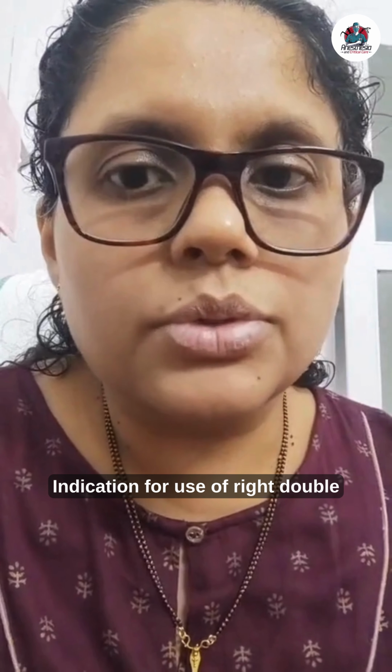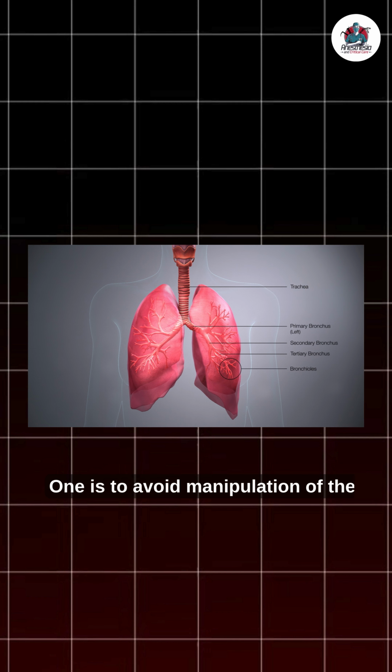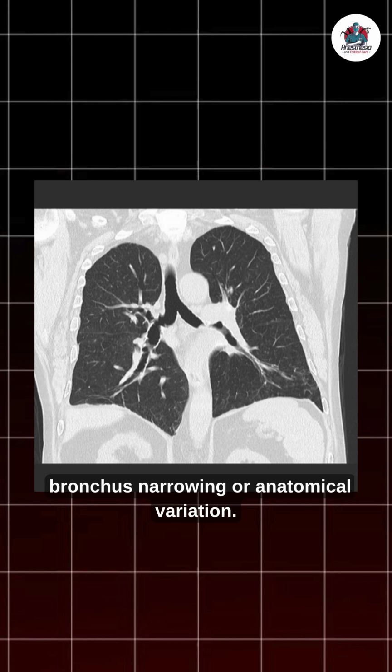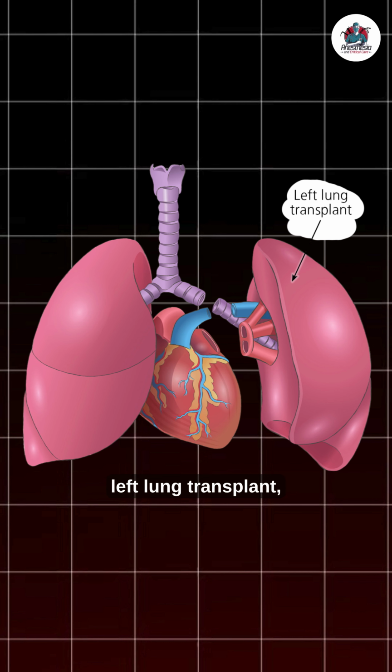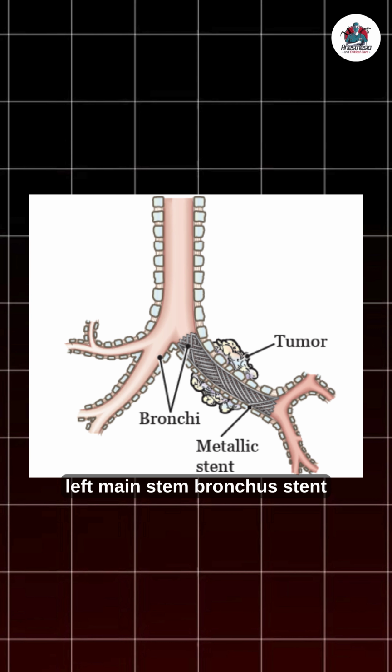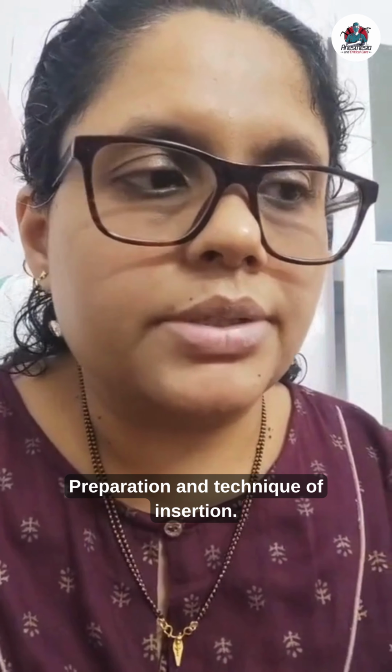Indication for use of right double lumen tube. One is to avoid manipulation of the left bronchus, or if there is a left bronchus narrowing or anatomical variation. Then in cases of left pneumonectomy, left lung transplant, left mainstem bronchus stent, and in suspected disruption of the left tracheobronchial tree.